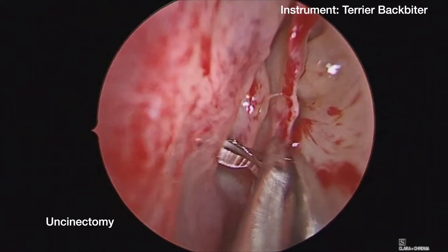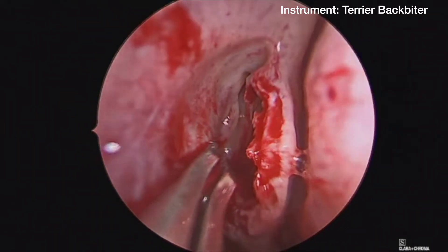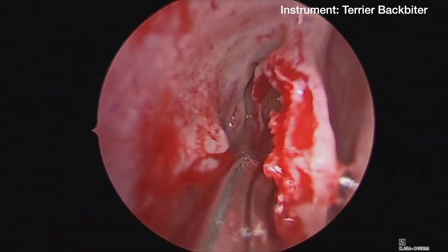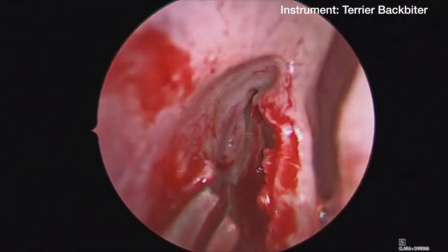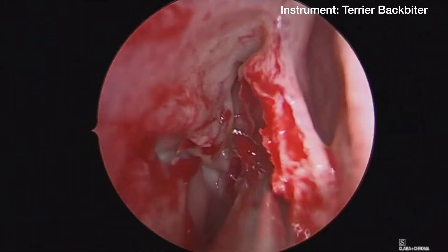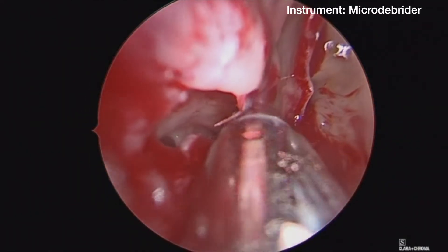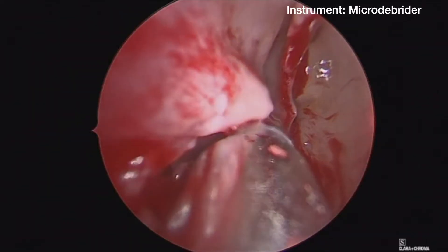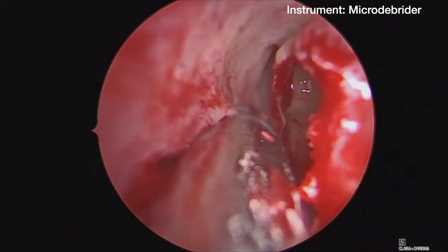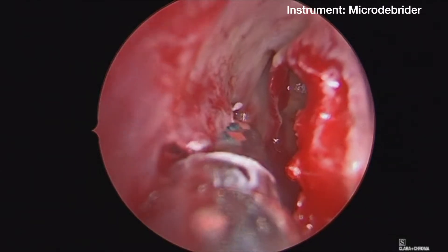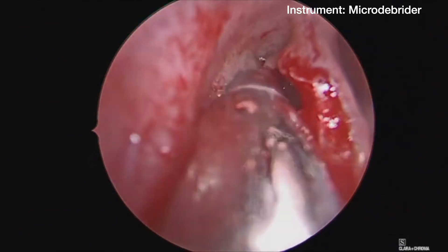Uncinectomy is then performed. This is initiated with a pediatric terrier backbiter and taken anteriorly toward the maxillary line. The maxillary sinus natural os is then appreciated. Since there was no sinus disease in the maxillary sinus, no antrostomy was performed in this case. The uncinectomy was completed with the microdebrider.